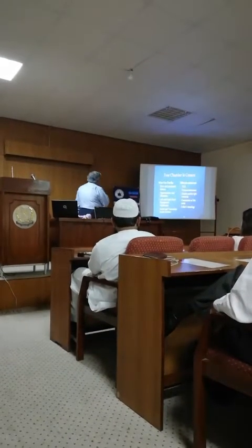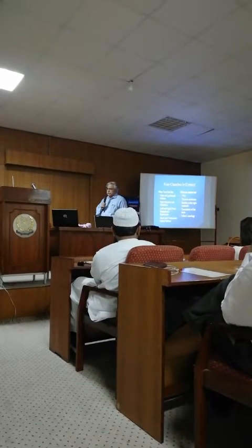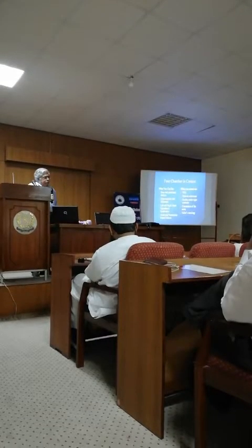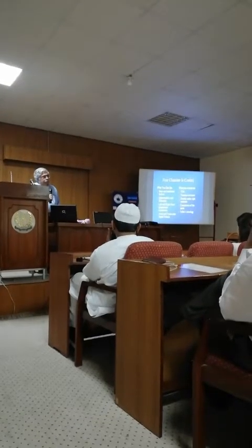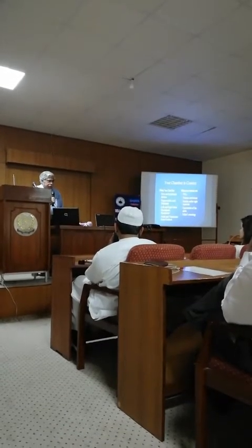Okay, so four-chamber view, we have completed our visualization of the four-chamber view. We mentioned initially that this is not the most powerful section that you have available, but this is probably one of the most important sections and the easiest sections to acquire, and will give you a lot of information.